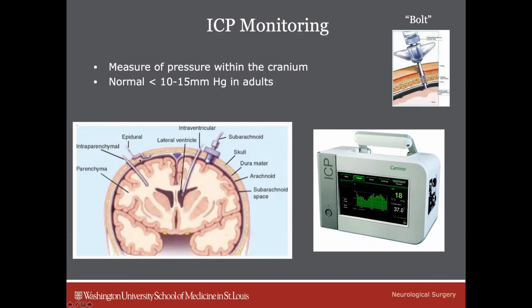Then there are also ways of monitoring it by putting in an epidural electrode. We do this sometimes after a decompressive craniectomy. We leave an ICP monitor in the epidural space to monitor. But otherwise, as a first line, we don't use epidural monitors. This is a standard Camino monitor that you have all seen in various ICUs here.